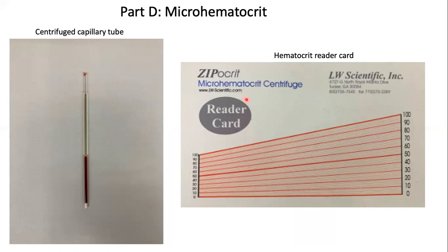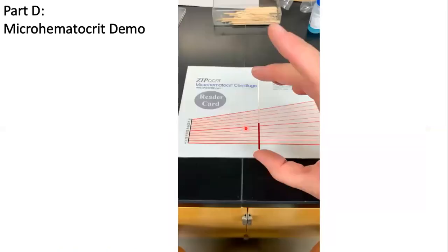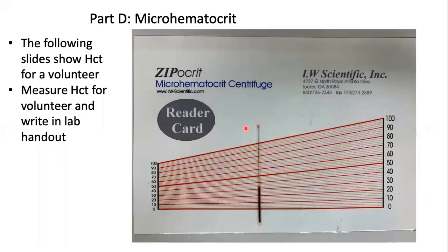All right, then here's a hematocrit reader card. You can watch the video on this snippet. And then you're going to measure the hematocrit. I explained it in the video, so go back and look at that.